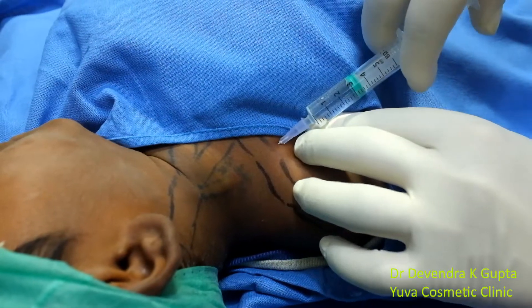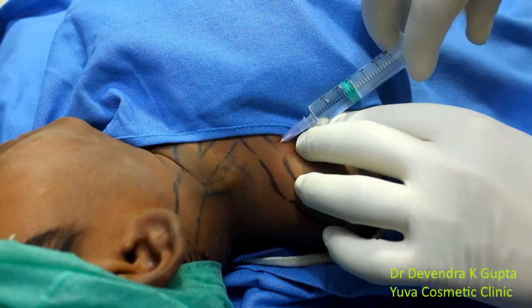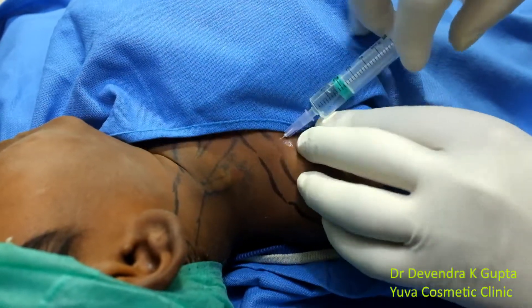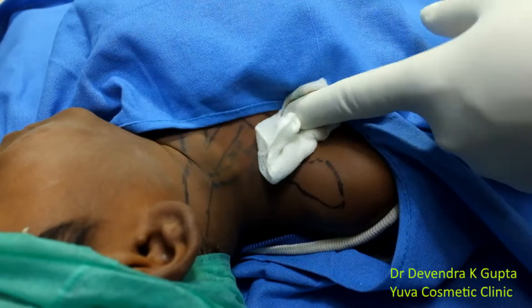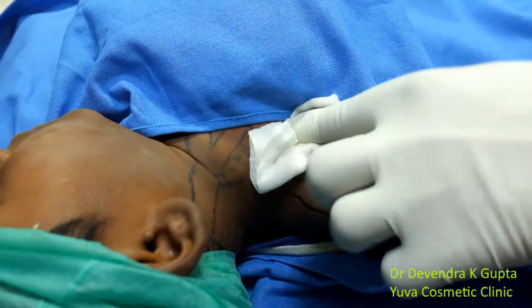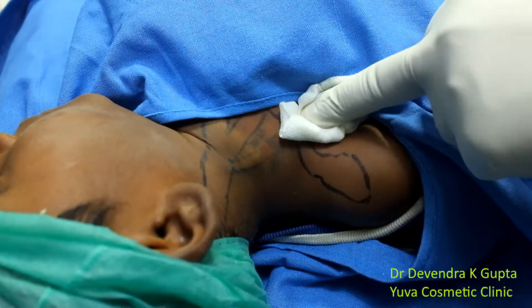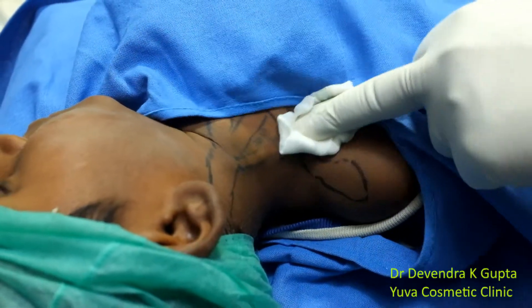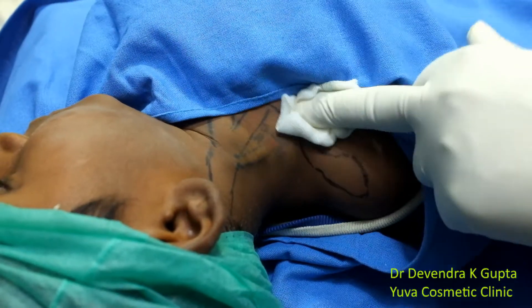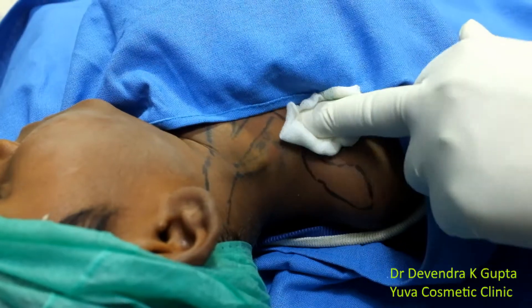Just inject 2–3 ml of this — it is a very dilute solution, 1% xylocaine with adrenaline. I have given 2 ml of the injection here. This is the infraclavicular approach to supplement the brachial plexus, because in some cases the ulnar nerve gets spared because of anatomical reasons or because of the low volume injected in the brachial plexus.